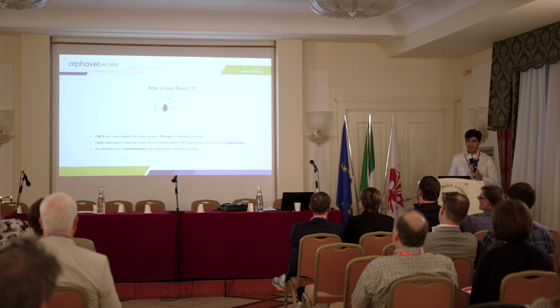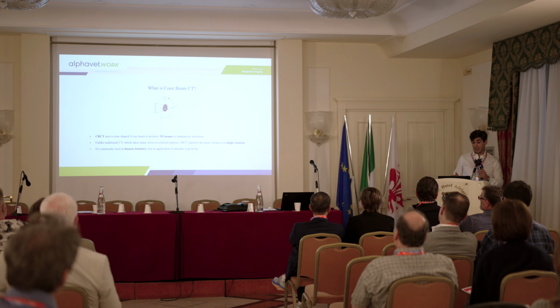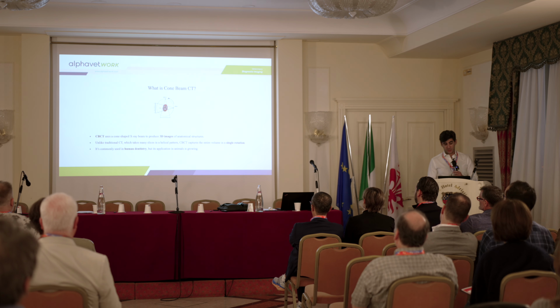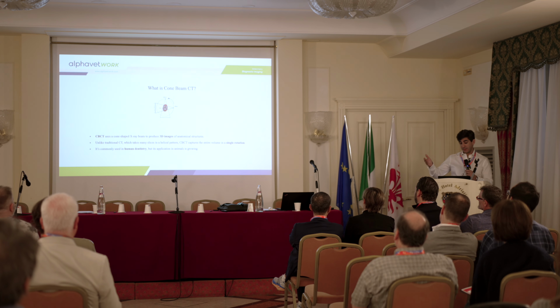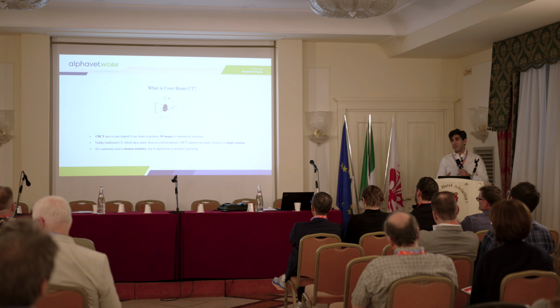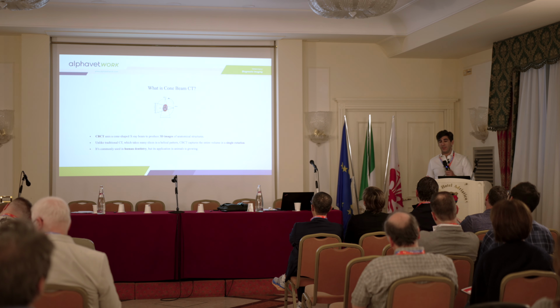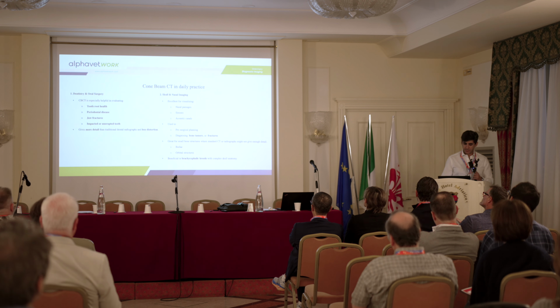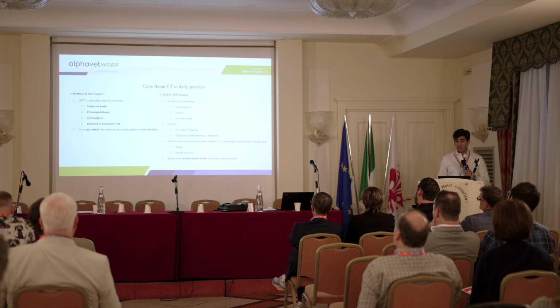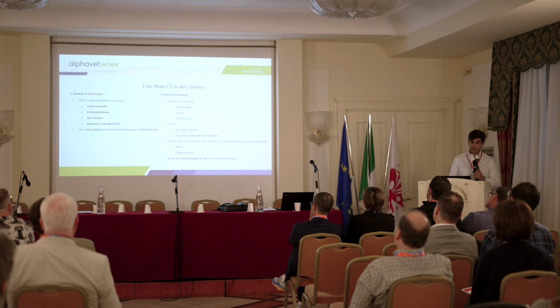So we all know that a CBCT is a cone-shaped X-ray beam that produces 3D images of anatomical structures, unlike the traditional CT, which takes a helical pattern with many slices. So the CBCT was well known in human dentistry. And it's clear to most of us that up to now, we use the cone beam CT for the skull, for dentistry and oral surgery.